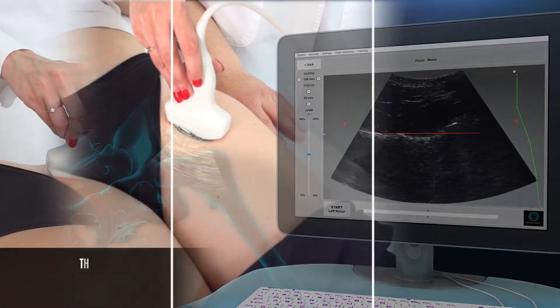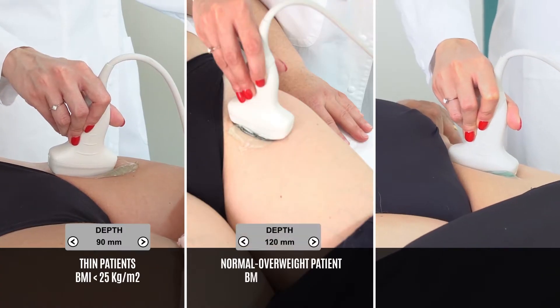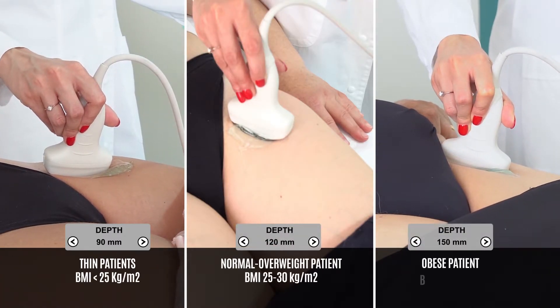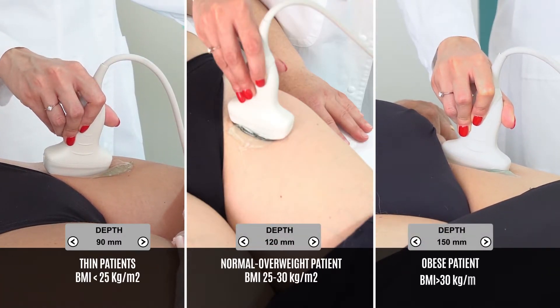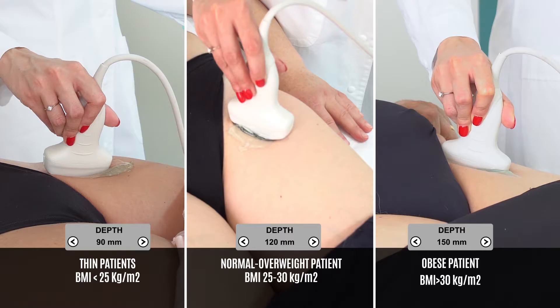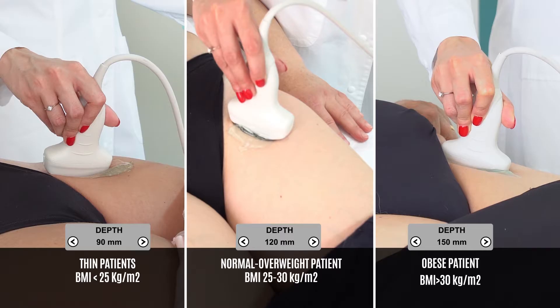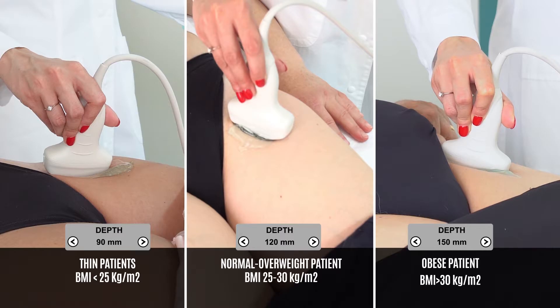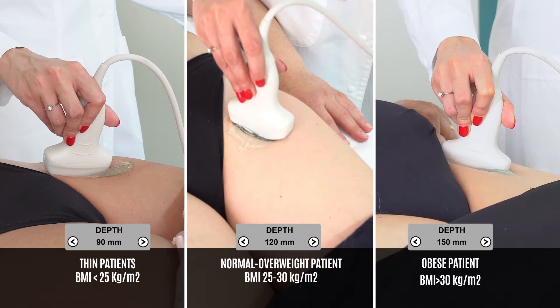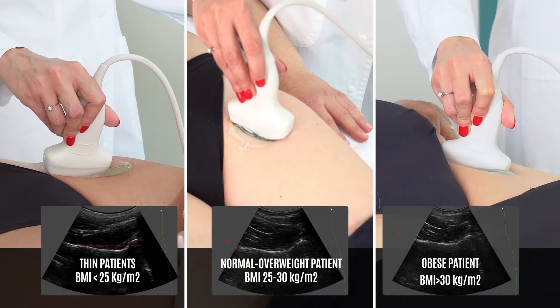The depth of scan varies according to the patient's BMI. It should be set on 90mm for thin patients, 120mm for patients with a normal weight or overweight, and 150mm for obese patients.